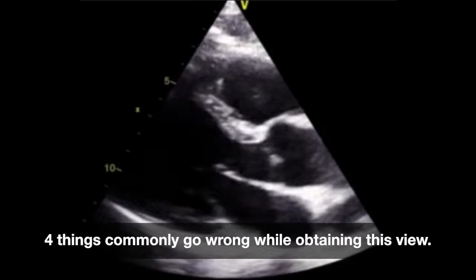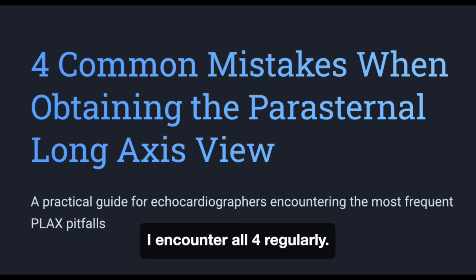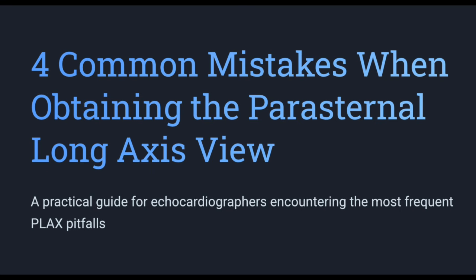4 things commonly go wrong while obtaining this view. I encounter all 4 regularly. Let us see what each error looks like and how it can be corrected.